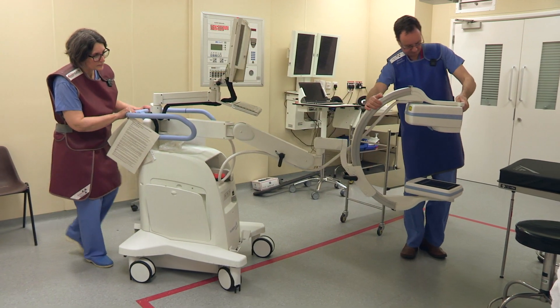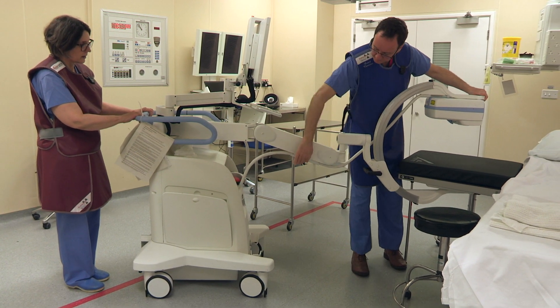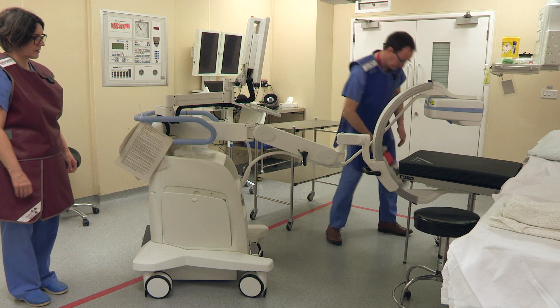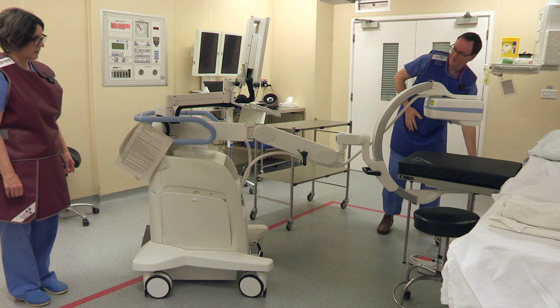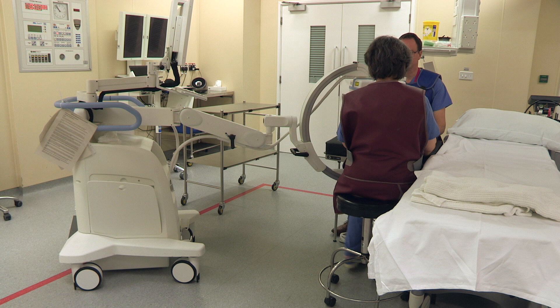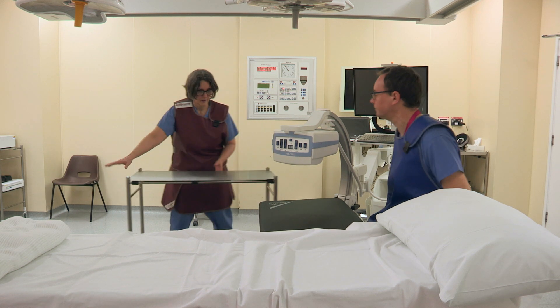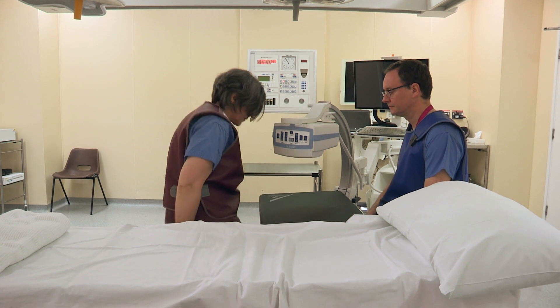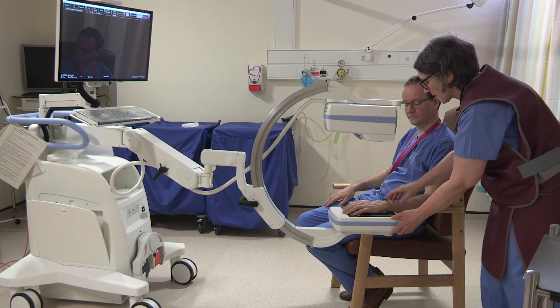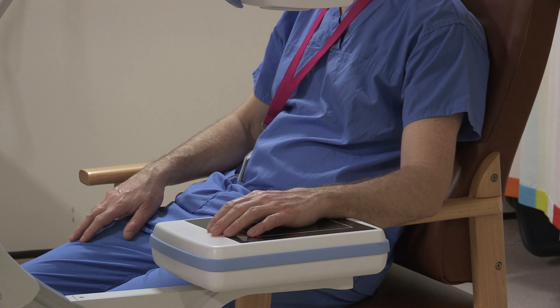For some operations, you will want to screen through the hand table. If you, as the main operator, will sit at the head end of the hand table, bring the machine in from the foot diagonal to fit underneath the hand table. To lower the C-arm, release the catch on the arm itself and gently manoeuvre the detector underneath the table. If the main surgeon is sitting at the foot end of the hand table, the image intensifier would come in from the head end. For hand injections, have the patient sit in and bring the machine in to the side of the injection, making sure that the patient's shoulder and elbow are in a relaxed position.